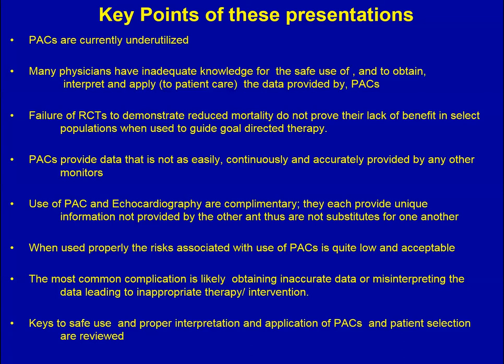When used properly, the risks associated with the use of PA catheters are quite low and acceptable. The most common complication is obtaining inaccurate information or misinterpreting it, and the keys to safe use and proper interpretation will be reviewed.